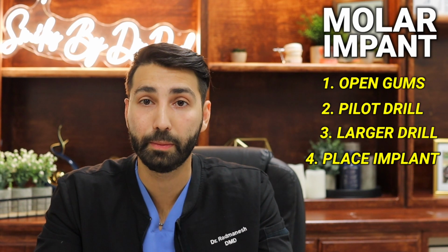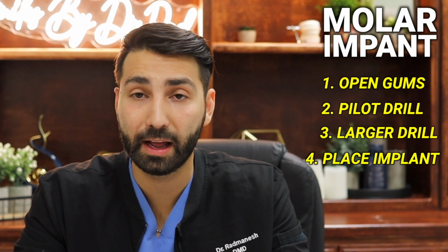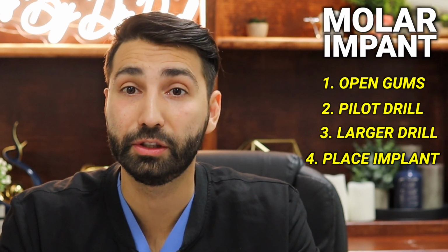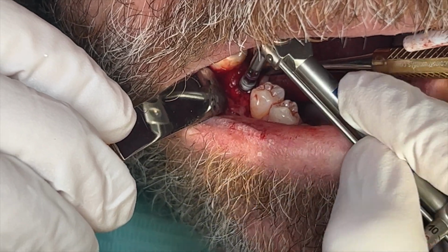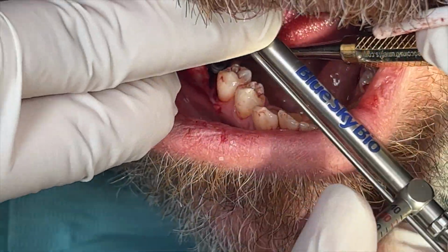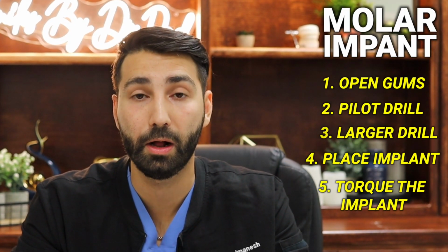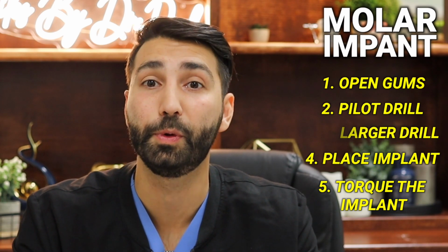This step is very important because we want to make sure the area is nice and flat. We're placing the implant at the right angle and making sure that we don't destroy any other tooth nearby. Ideally, we want the implant to actually torque out a few millimeters above bone level. That tells us that the bone is very strong and all those bone grafts that we placed months ago have really integrated super well. And this is a critical step because a lot of times the bone doesn't integrate as well as we would love it to.